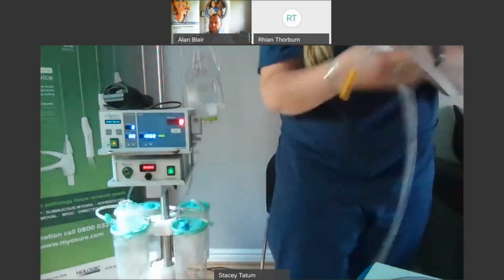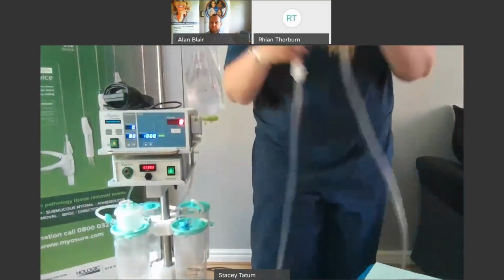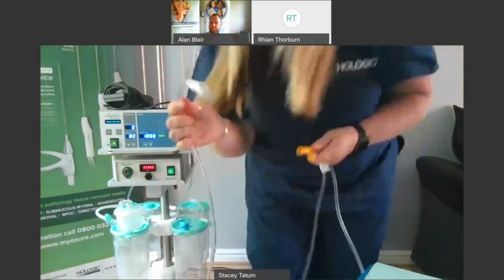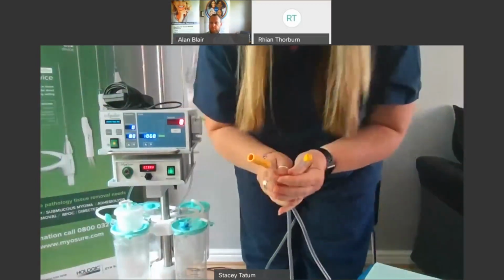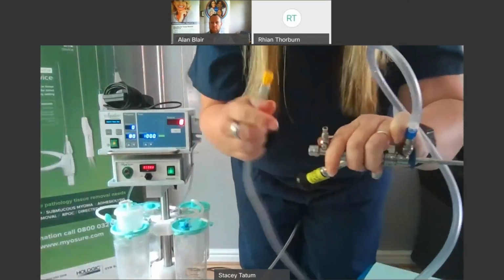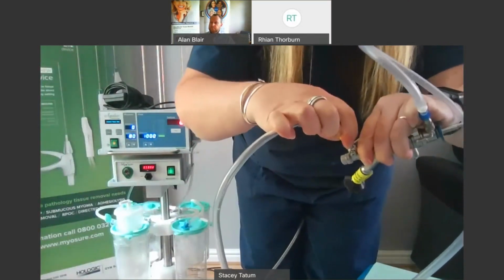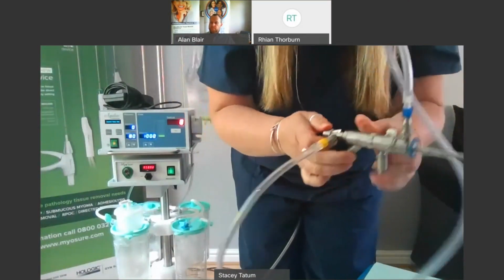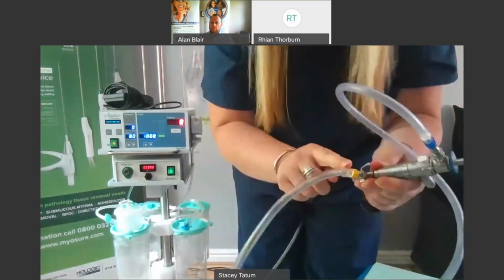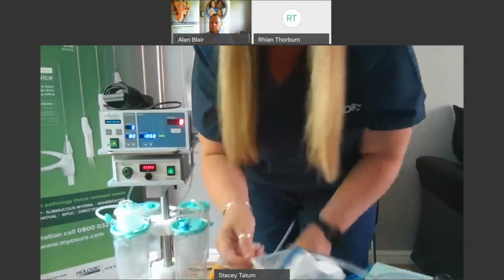And then your outflow. I've unraveled it so that you can see that it's Y-shaped. So there's the Y bit there. It has 2 yellow ends and a white end. Now the 2 yellow ends are going to stay with your patient. Again, one is going to go onto your scope, and your outflow channel will have a little yellow arrow on, so it's color coded again. If that yellow arrow has faded, then the arrow pointing away from your scope is your outflow. So one goes on your scope, and this yellow end will go on your under buttock drape.